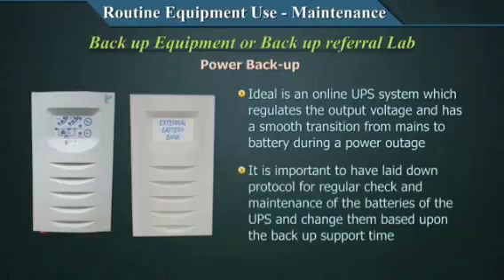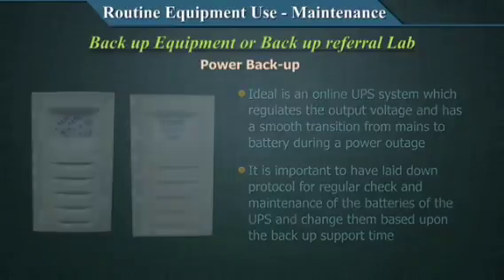It's also important to have laid down protocols for regular checks and maintenance of batteries of the UPS and change them based upon the backup support time. If you have an online UPS system or any kind of UPS system, it's not just enough to have it, but the same kind of maintenance plan should be available for the UPS. Entire thing should be documented. Like any other equipment, UPS also deserves the same kind of treatment as in your equipment management.